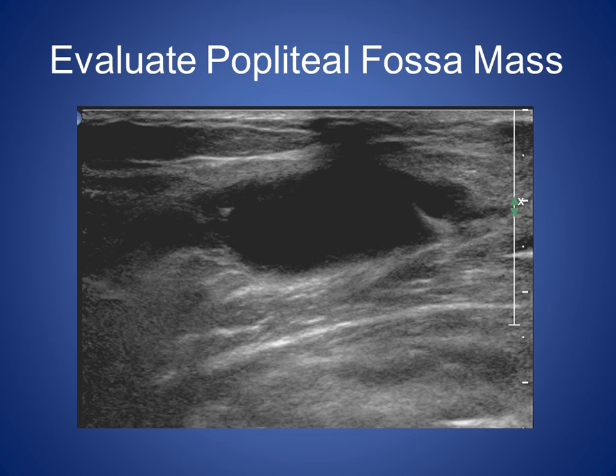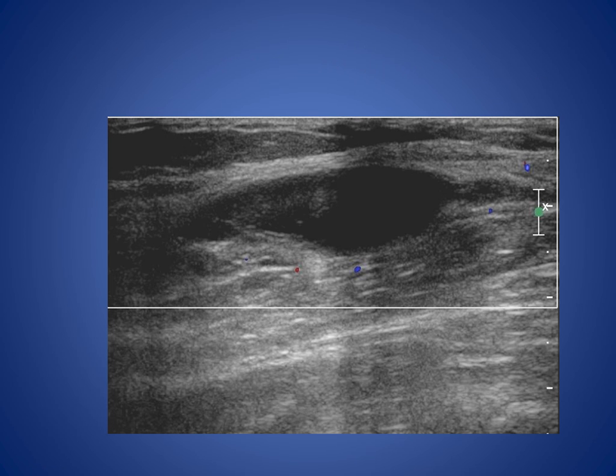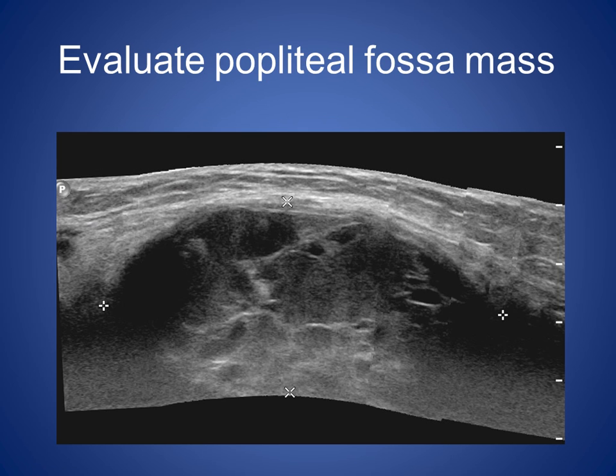So this is something I'm sure we've seen often. Please evaluate Baker's cyst. So you go and you look at it: typical appearance of an anechoic cystic structure, posterior through transmission, in the right location, and no flow. Baker's cyst.